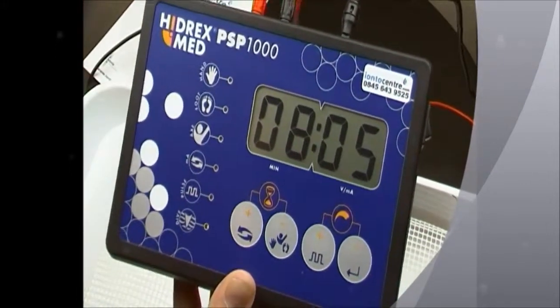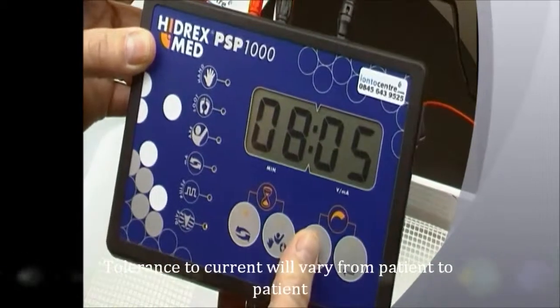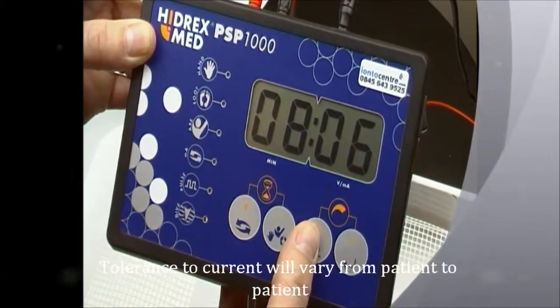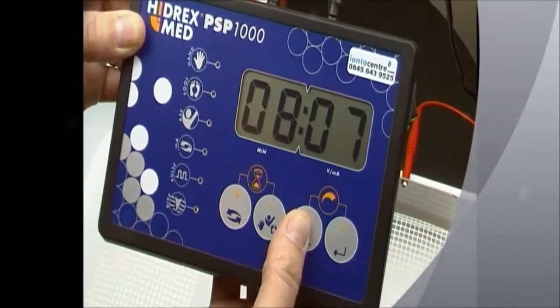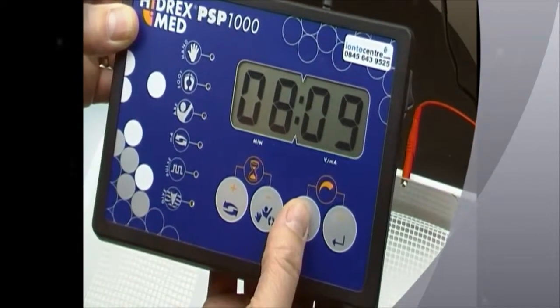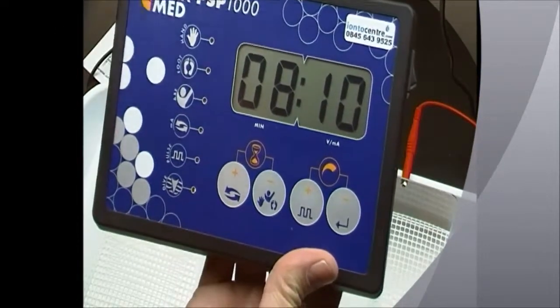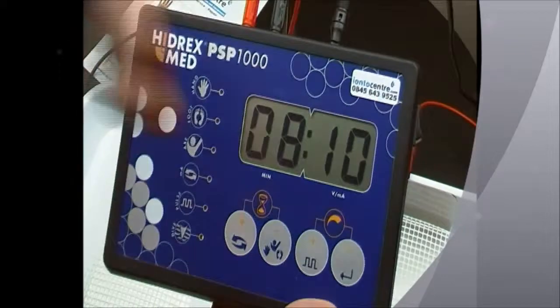You want to establish whether the patient is comfortable. If everything's fine, slowly start to bring the power up to the maximum comfortable level the patient can tolerate. They'll be feeding back to you telling you whether it's uncomfortable. Just sit there for the eight minutes, and after the eight minutes the machine will automatically power down.